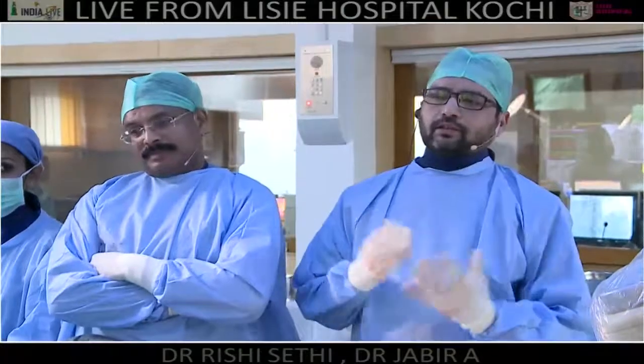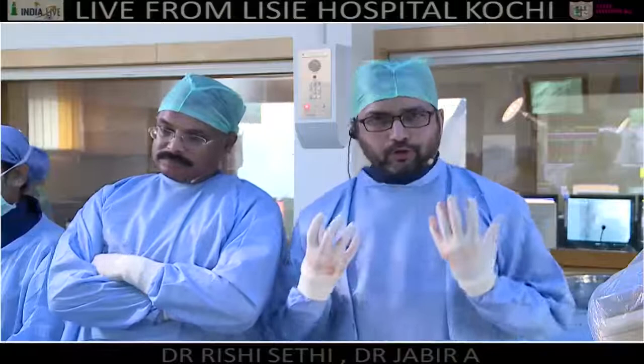No, Dr. Pillai. The point is the beauty of physiological testing is that it does not only correlate with the severity of the lesion. It correlates with the area, it correlates with your microcirculation, it correlates with your area of supply.